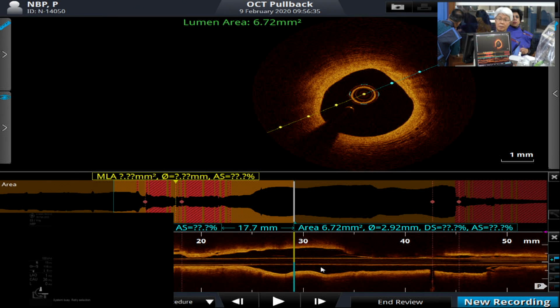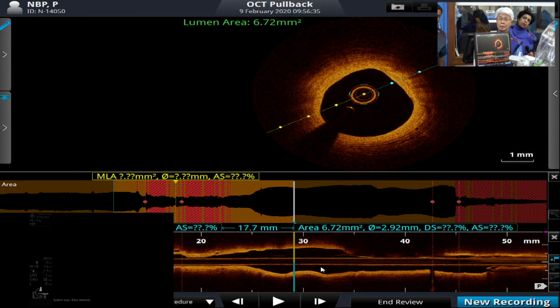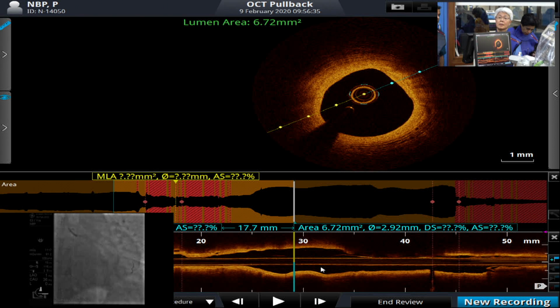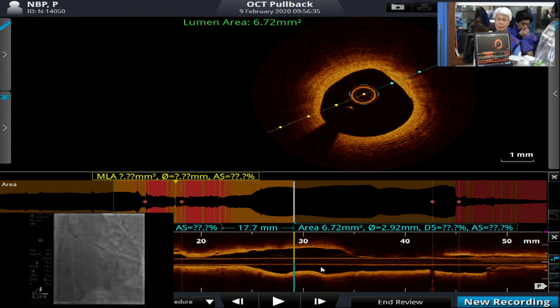His question was whether you are concerned about producing any damage in the normal artery above the stent, and I think it's a fair concern. I do not know if I would be that aggressive and go too much outside of the stent, because certainly you can increase the risk of restenosis by doing that.